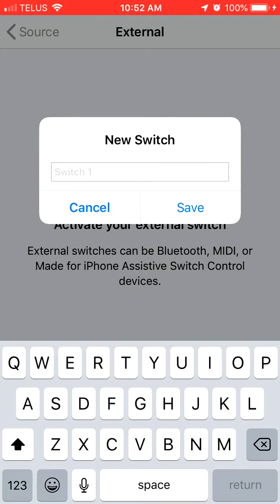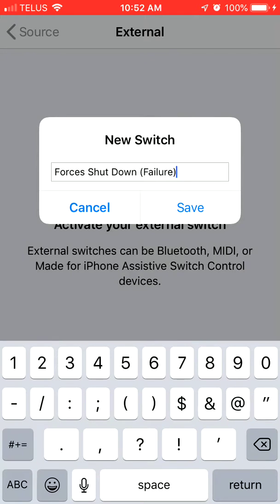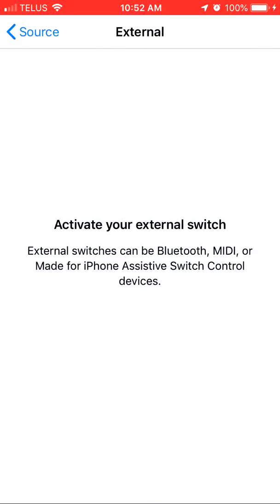And we're going to label this one as Forced Shutdown. And in brackets labeled Failure. Now this button is associated with disabling iOS switch control in case the iOS switch control was acting erratically or wasn't functioning as expected. You could press this button, it would interrupt any of the iOS switch control commands currently executing and would just disable the iOS switch control, allowing you to turn off the cane and back on and then go back into it and hopefully have solved any issue that may have happened. So we're going to click Save.